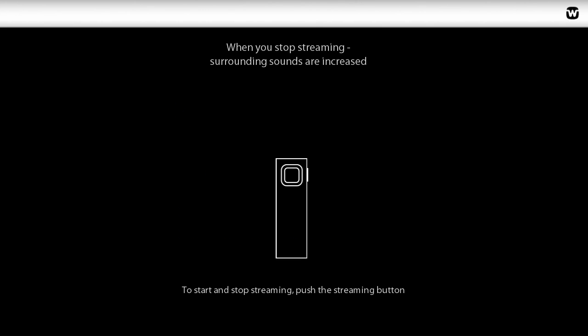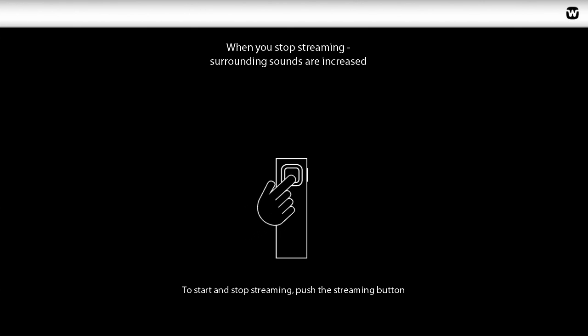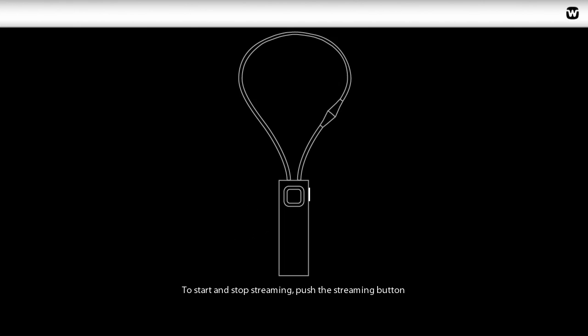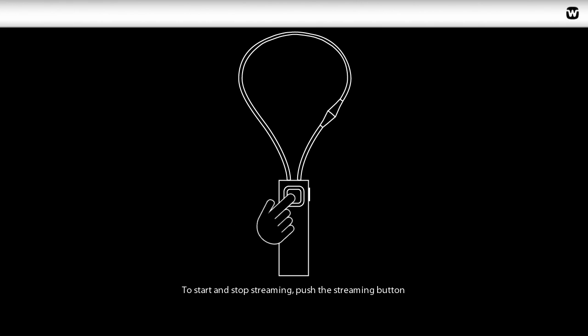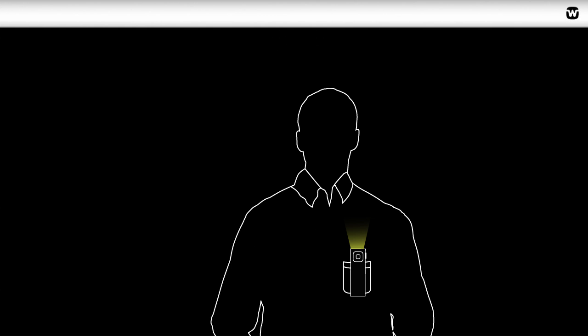To stop and start streaming, simply push the streaming button. You can also use the push button on your Comdex. A constant green light on the top LED indicates that the device is on and streaming.